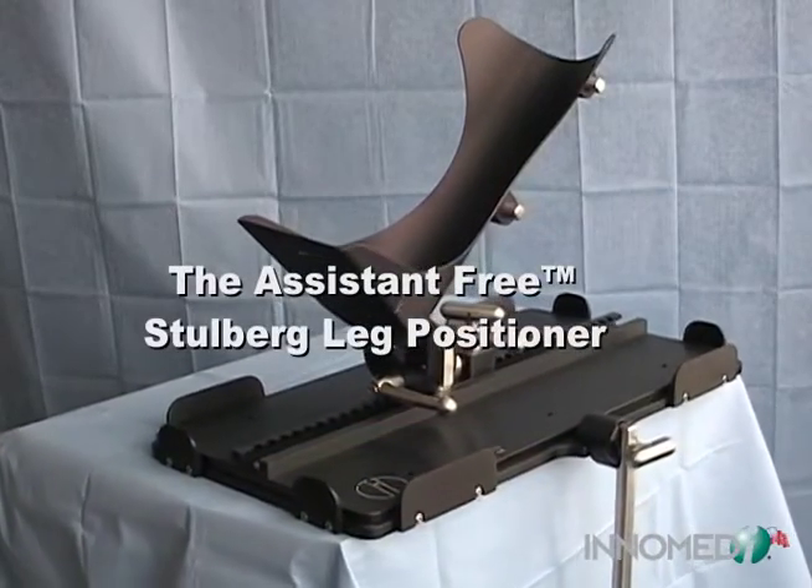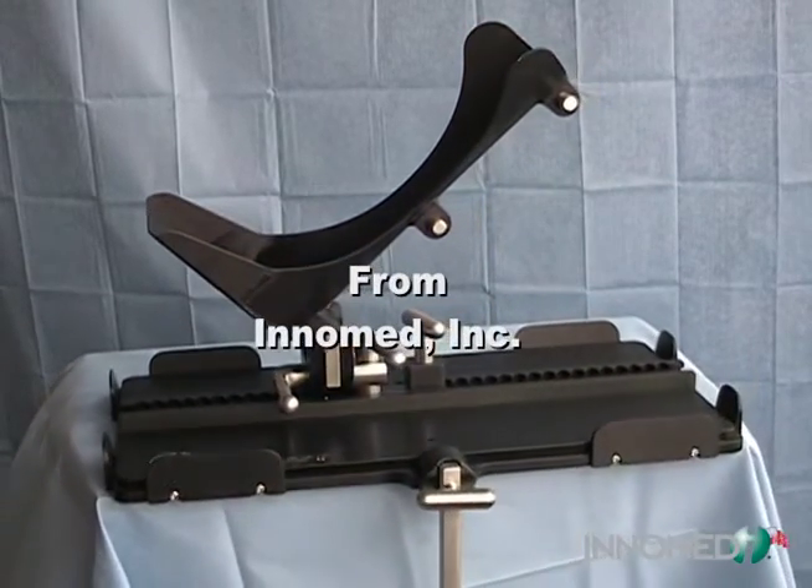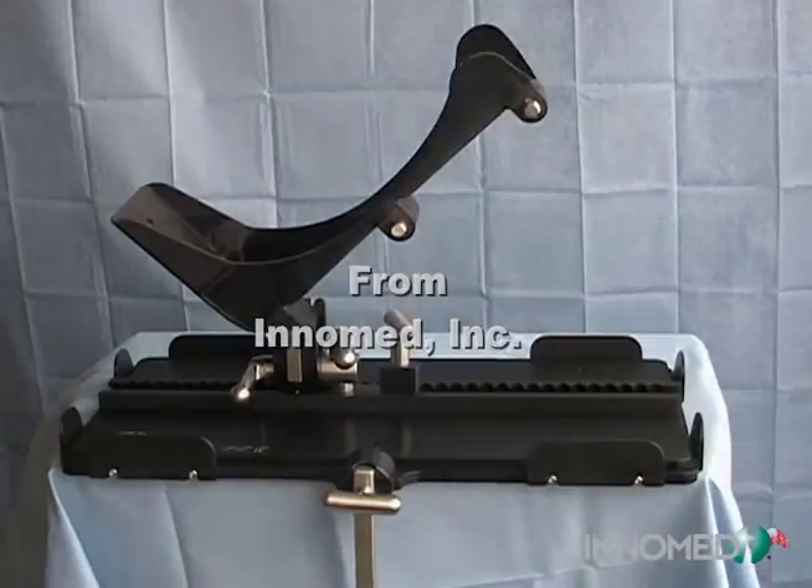The Assistant Free Stulberg Leg Positioner is designed to securely hold the leg during knee surgery and offers the versatility of several adjustments throughout the procedure.